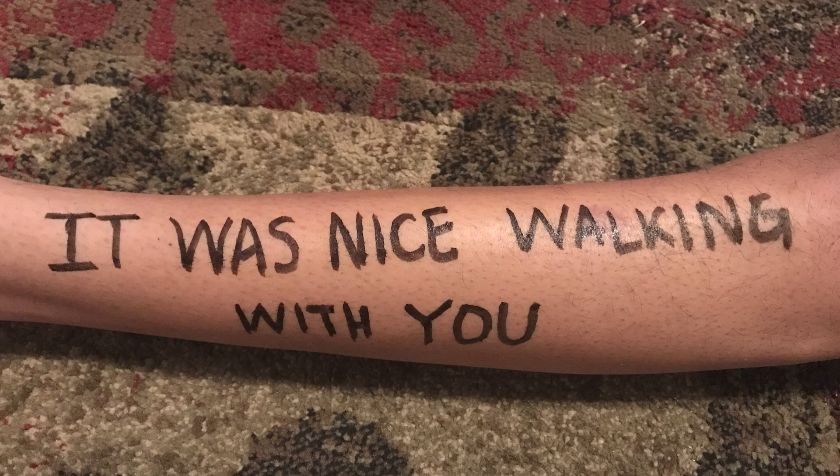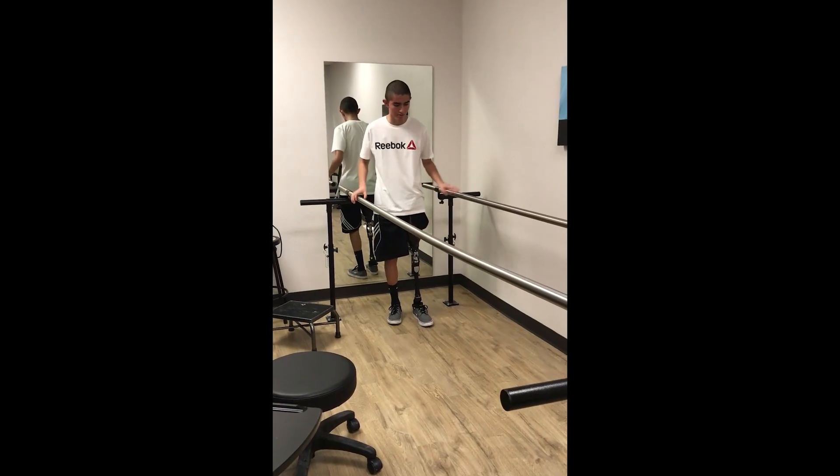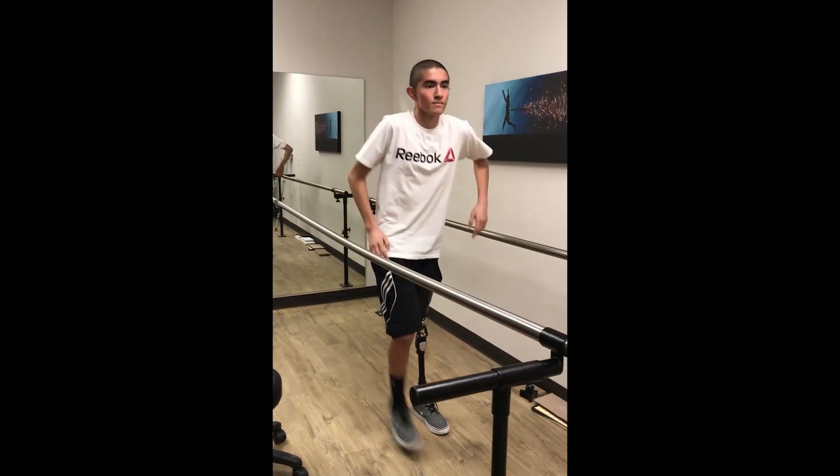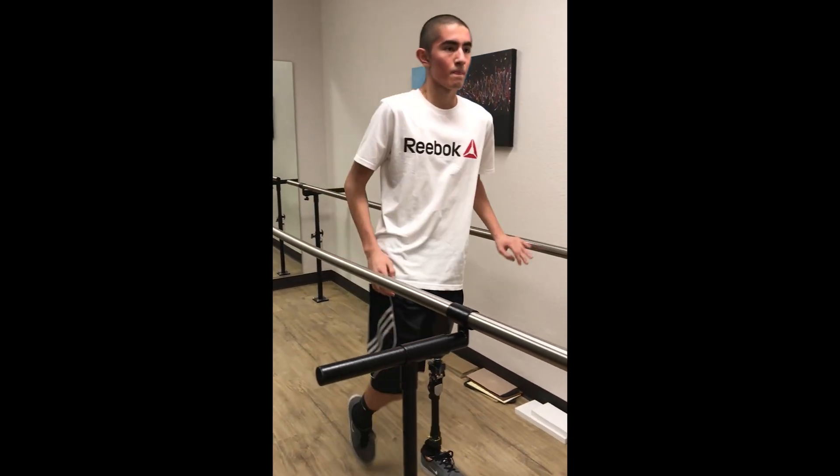The first real leg I ever received was when I was 15, after losing my leg to cancer — a mechanical knee. This is almost like the training wheels of prosthetics. Every single time you took a step, you had to land on the heel of your foot. If not, the prosthetic wouldn't lock and you would buckle and hit the ground. I hit the ground a lot learning to walk again, while doing chemo and dealing with cancer on top of that.